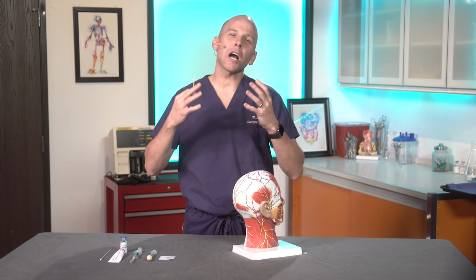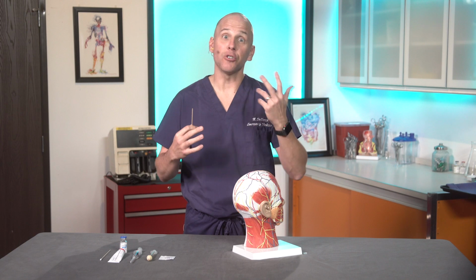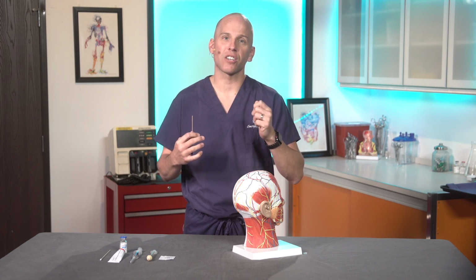So let's talk about 3 nerve blocks. Well, actually 2 nerve blocks and 1 trigger point injection. We're going to go over the occipital nerve block, the paracervical trigger point, and the sphenopalatine nerve block.